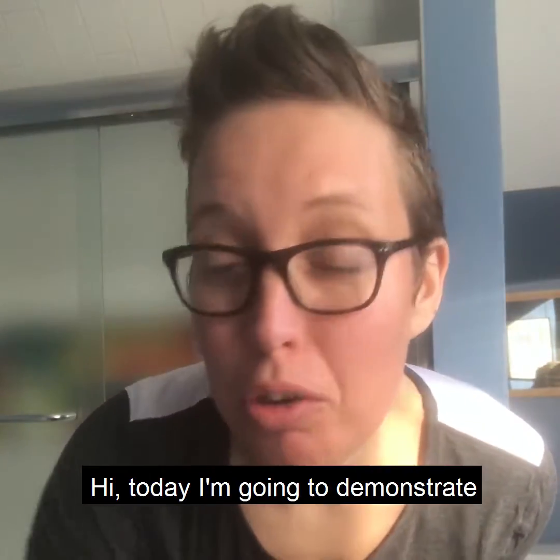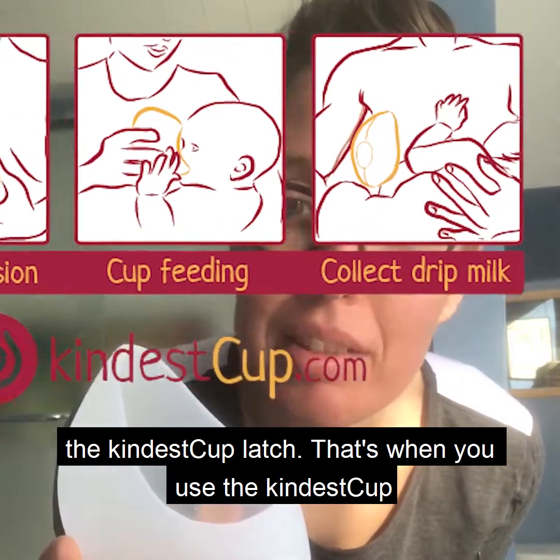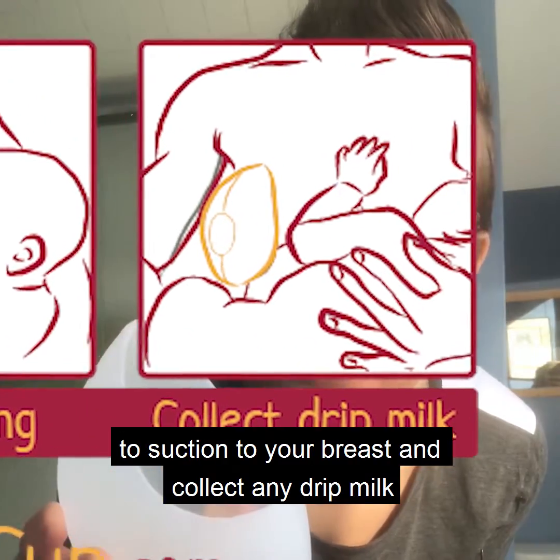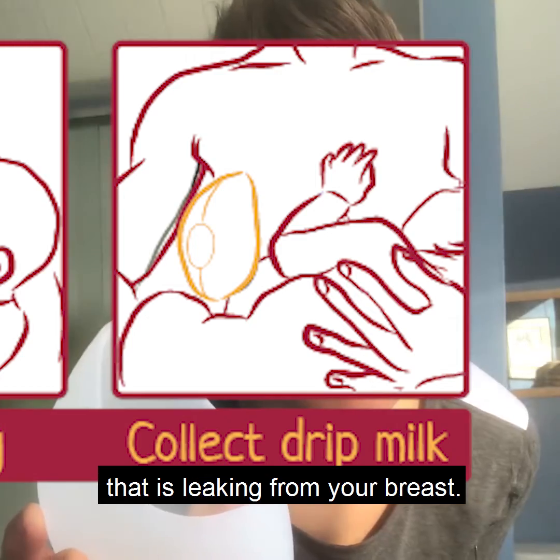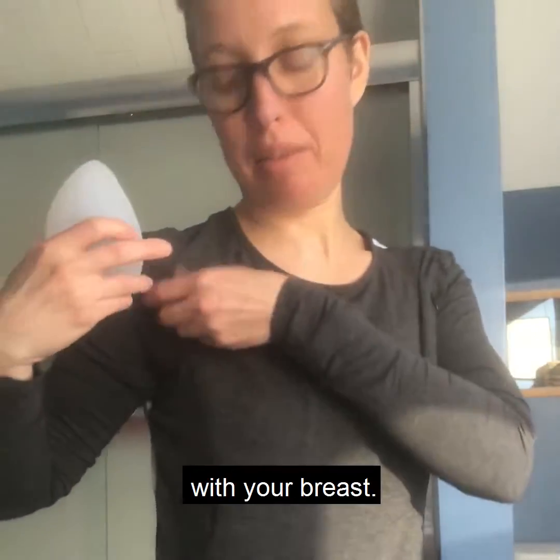Hi, today I'm going to demonstrate the kindestCup latch. That's when you use the kindestCup to suction to your breast and collect any drip milk that is leaking from your breast. First, line up the opening of the cup with your breast.